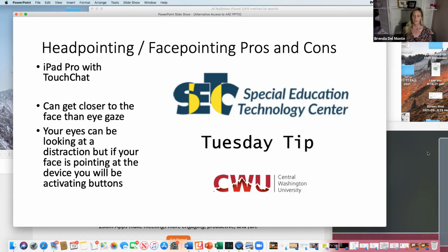I do like that you have options as far as the smile, the blink, and a few other ways. Sometimes we have kids that always smile when they're on the one they want, and so it's a natural access method.